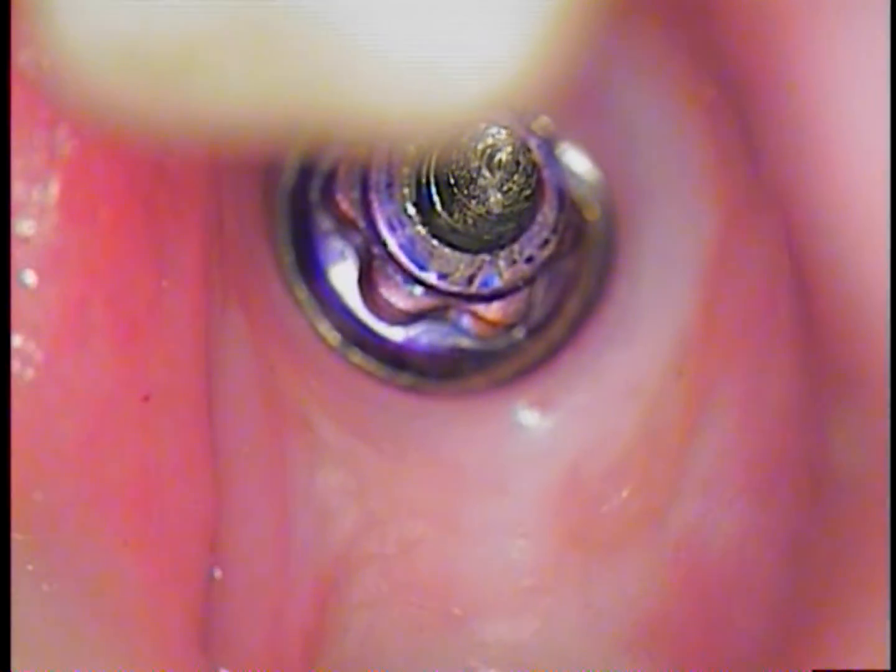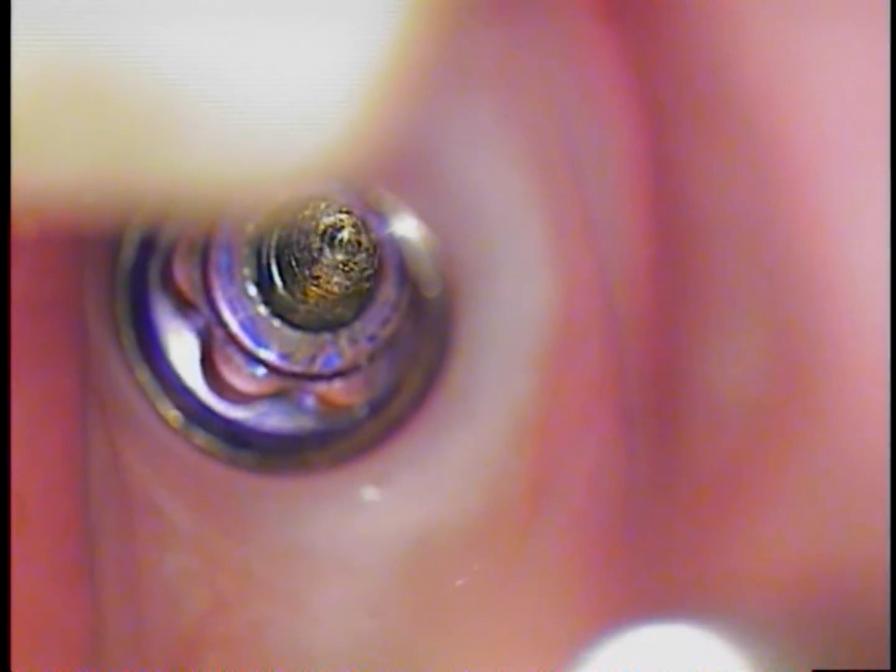Angulation is important. I have a straight-line view of the long axis of the implant. I did not have a centering device or any type of lab analog that you could possibly use in this case to ensure your axis is straight with the implant. The problem with that is there's a large distance from the broken screw to the top of the orifice of an analog. I had that idea but decided not to go with it because the shaft of the burrs were a certain length and I could not travel all the way down through the shaft with confidence. So direct vision for me was the best way to go.